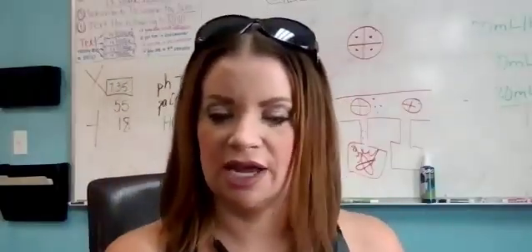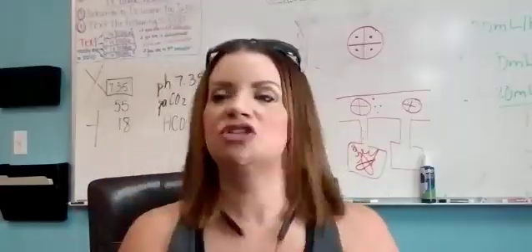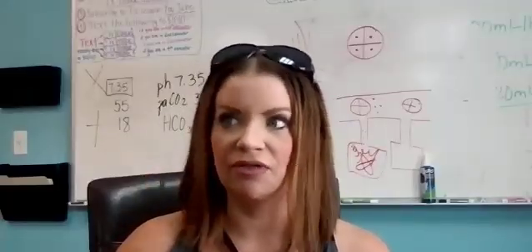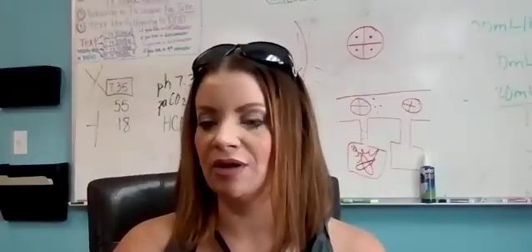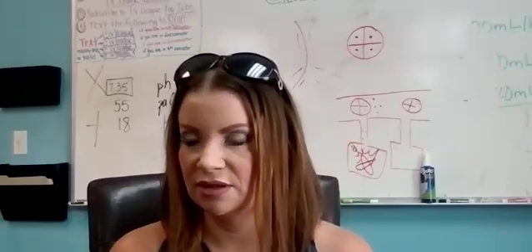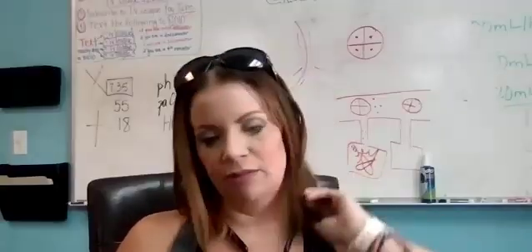Correct. All right. So when you are doing ventilation, it is very important to note whether your patient needs pressure or they need just oxygen. There's pressure support, and then there's trying to get the oxygen in. This is pressure really only. These patients probably aren't hypoxic per se. Maybe some of them are, but really this is pressure support. Does that make sense? Yes. It's for people that have floppy alveoli or alveoli that don't work. Okay. What's a Vapotherm?